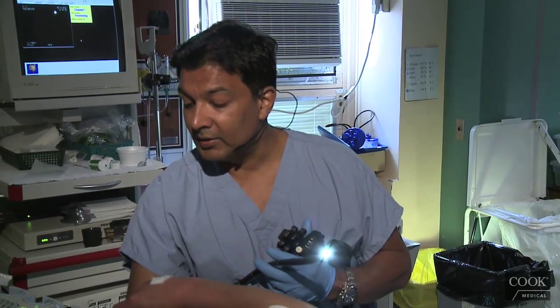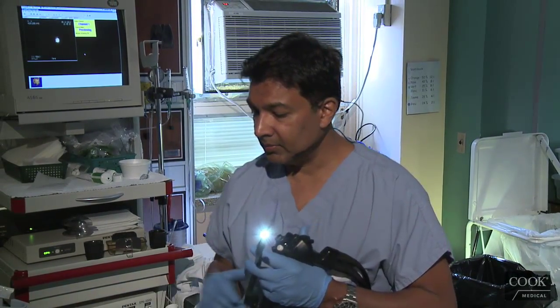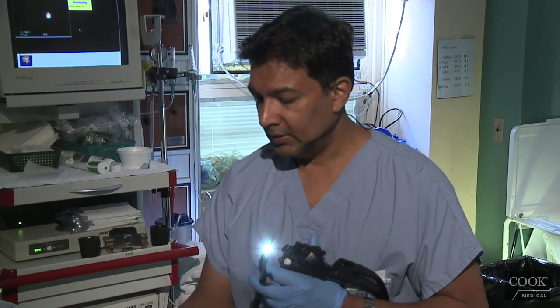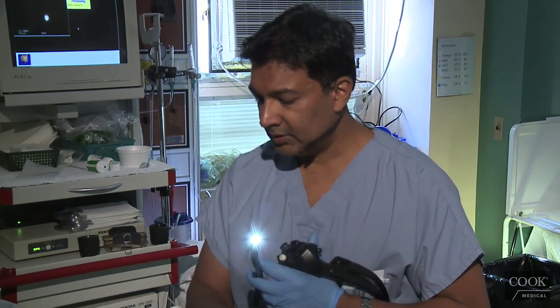Madame, restez sur le côté, s'il vous plaît — sur le côté, comme ça. Mettez votre bras comme ça. OK, c'est ça, super. Madame, juste restez comme ça.